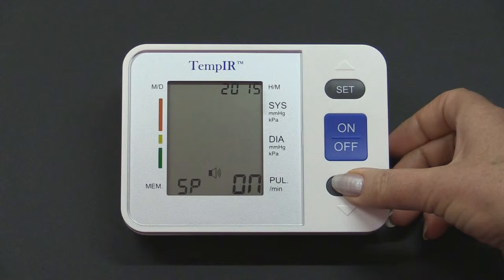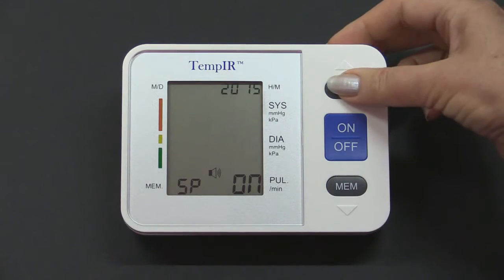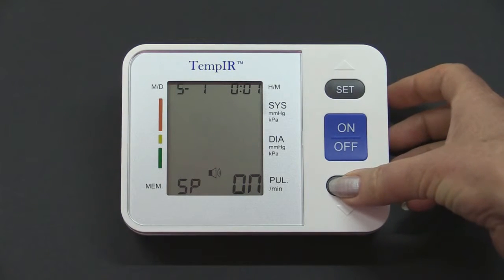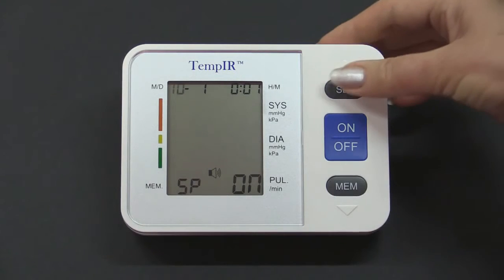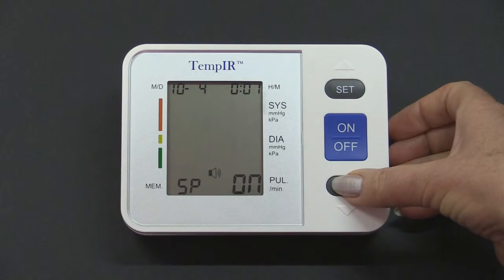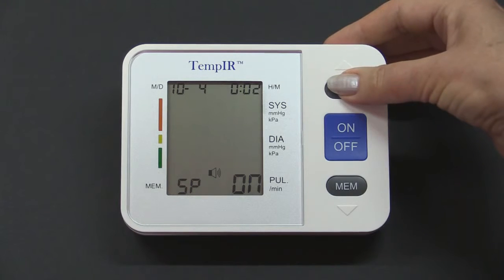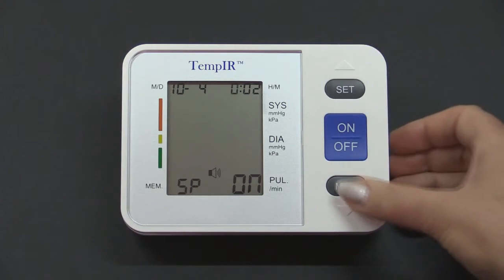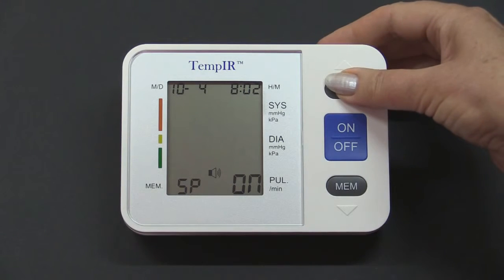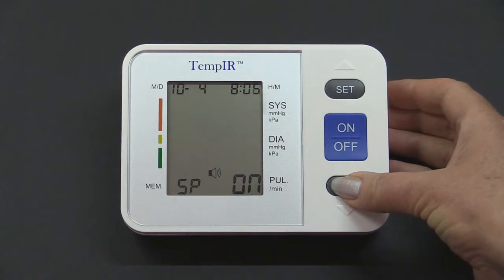Each click will cause the numbers to increase. Press Set again for month and Mem to change it. Repeat the process to select the date, again changing with the Mem button. In this example, we have set the date to October the 4th. By pressing the Set button once again, you can adjust the hour. Holding the Mem button down will cause the numbers to change faster. Finally, select the minutes and adjust them with the Mem button.